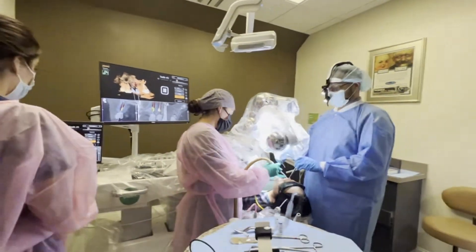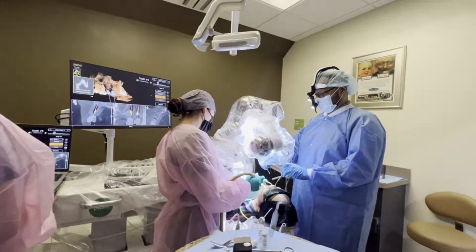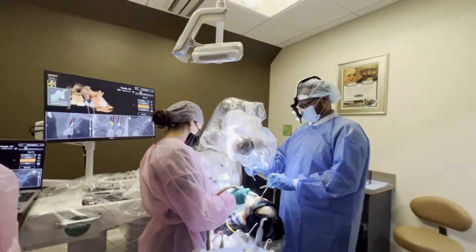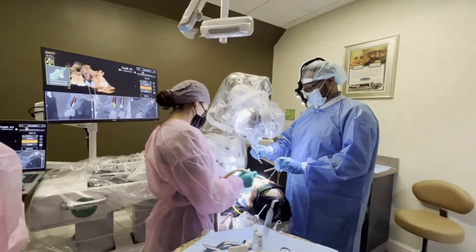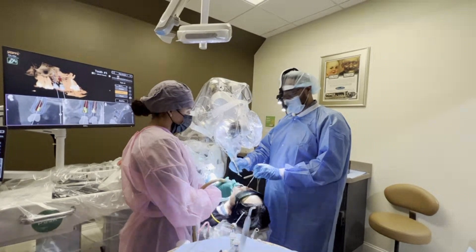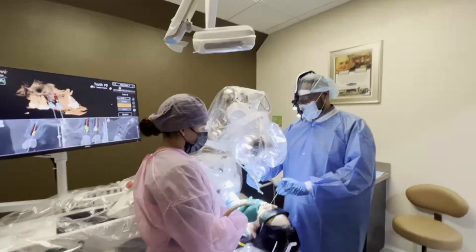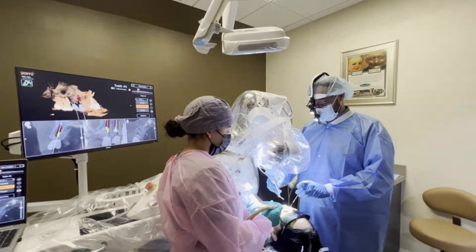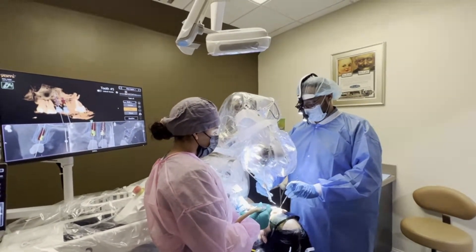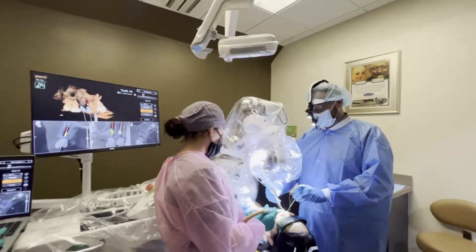We're going to place the second implant now. The doctor is still always looking into the oral cavity — I'm not looking at the computer at all. So I'm not changing the way I have been doing my surgery. There are voice prompts that we give to the computer operator.